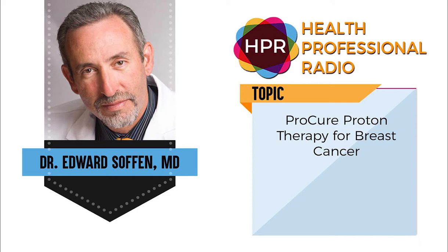So women, for example, who have left-sided breast cancer as opposed to breast cancer on the right side will benefit a little bit more from protons because the heart is on the left side and can be spared much more than conventional radiation. Women who have lymph node positive disease, stage 2 or stage 3, will also benefit more from protons because the radiation treats not only the breast, but the lymph nodes under the arm and under the clavicle. So in those women who have lymph node positive or even left-sided breast cancer, there's even more of a benefit to protons.